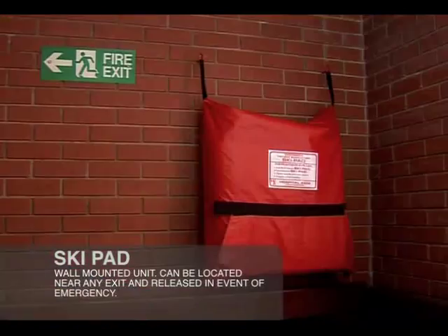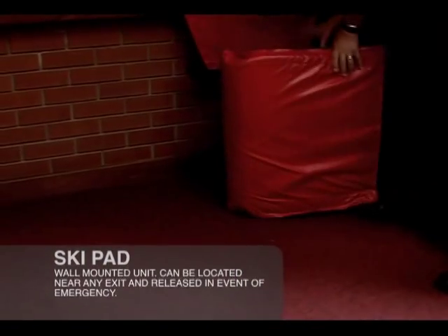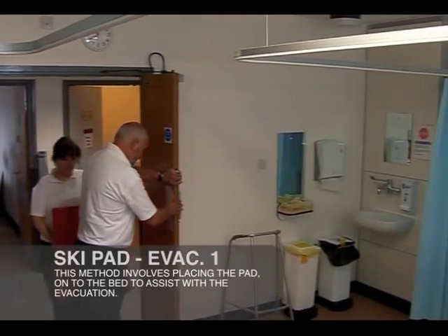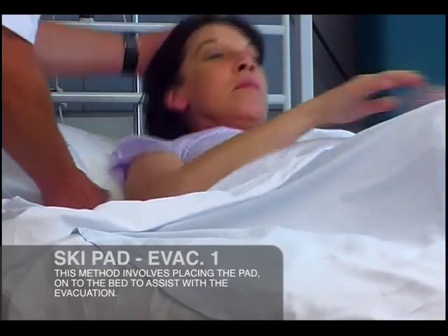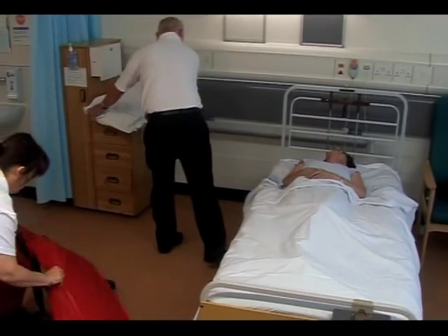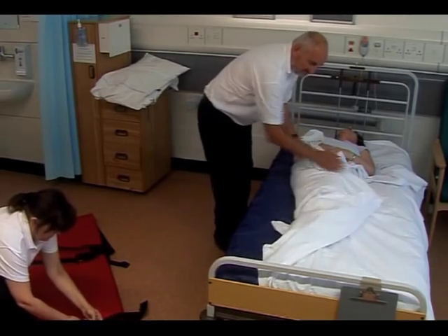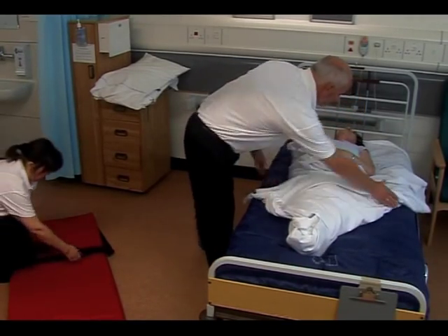When required in an emergency, release the Velcro strap on the outside of the case and the ski pad will automatically slide out ready for use. The ski pad can be carried to the area where evacuation is required and if possible, hold back any doors that can be secured in readiness for the escape. If space allows, prepare the patient or resident for evacuation by rolling them onto their side and wrapping them in the bedding. This will also help to ensure that they are kept warm and protected from the tightening of the buckles.